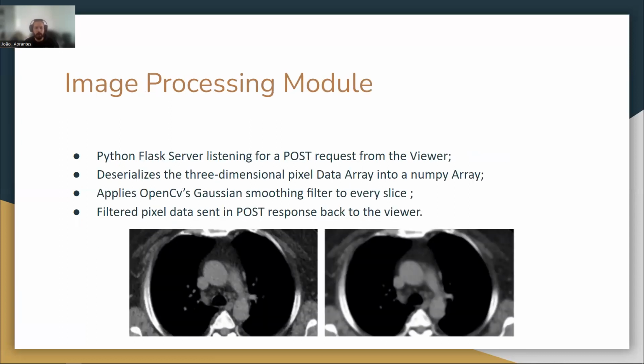Our main model, or external model, was developed inside a Flask server, as a small Python script that uses OpenCV to apply a Gaussian smoothing filter.